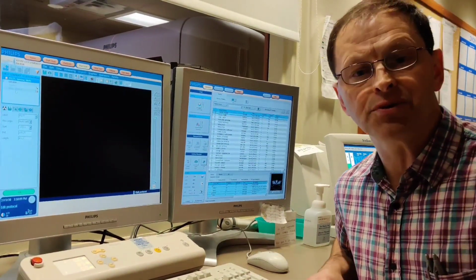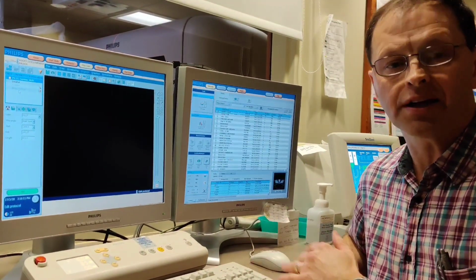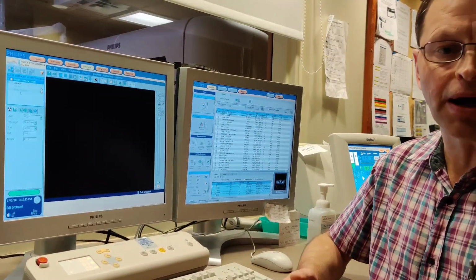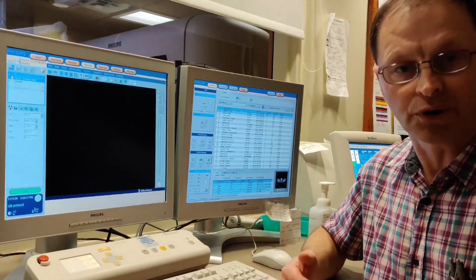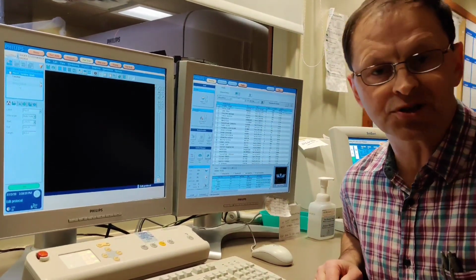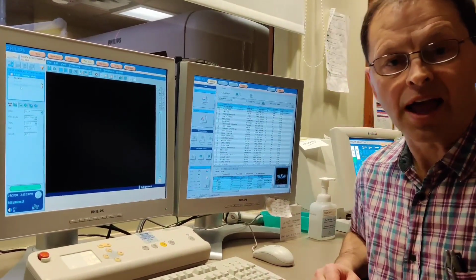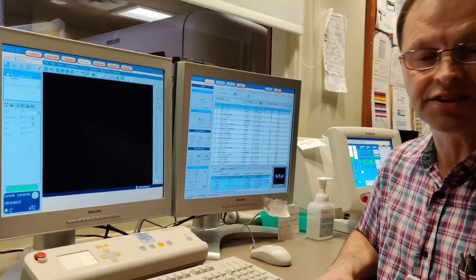The other thing I have to do yet is prime the injector and do a test injection. You can either do your pilot and then the test, or the other order. I'm going to proceed for this demonstration by doing the pilot, and then we'll move over to the MedRad console, and we'll go through the steps that you need to follow there.